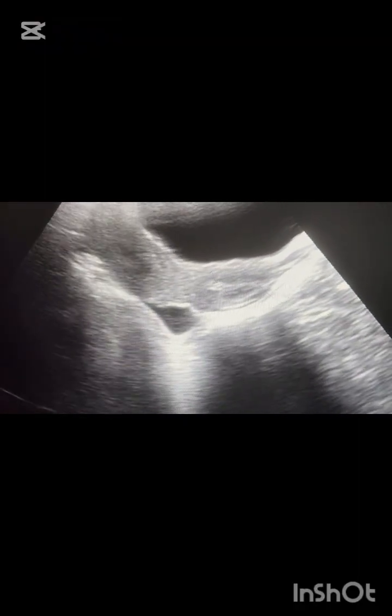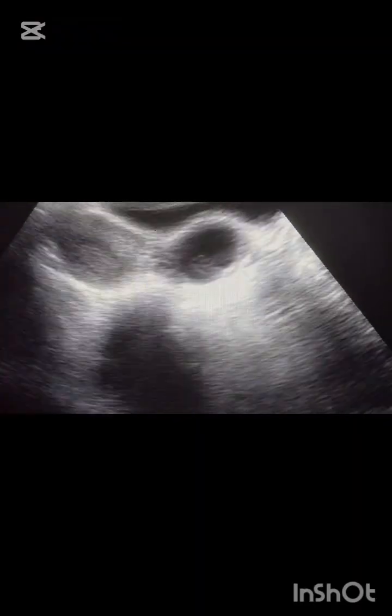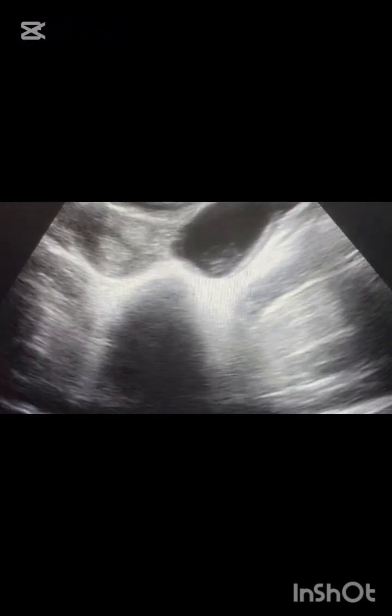This patient presented with severe lower abdominal pain and dysmenorrhea. During the scan, we found pelvic inflammatory disease and a left hemorrhagic ovarian cyst, measuring about 40 mm by 35 mm. That's all for today. This is an ovarian cyst and fluid seen in the cul-de-sac.